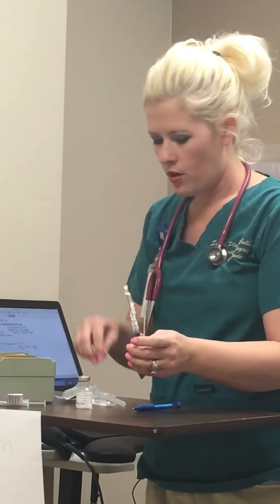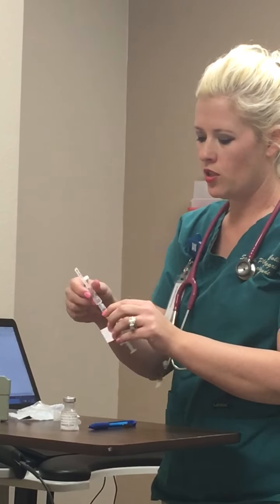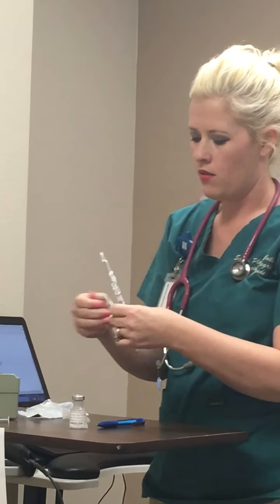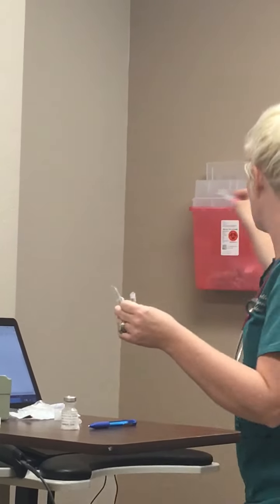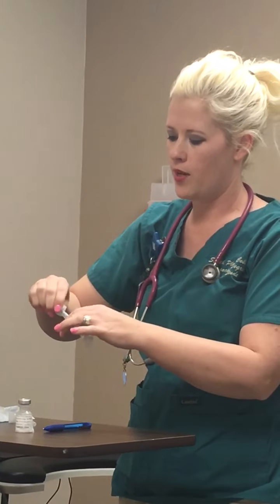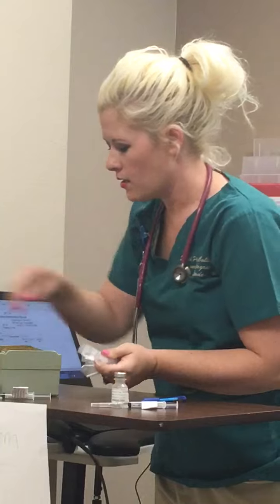Before I go any further, I'm going to go ahead and attach my new needle to my IM injection. So I'm going to take off and dispose of my needle that I drew up with straight to the sharps and attach my new needle that will go into the patient. Okay, I'm going to go ahead and clean up my mess in the med room.